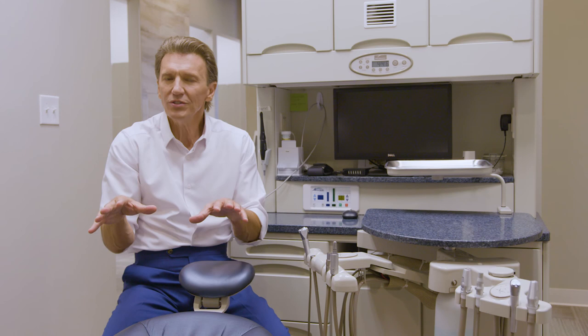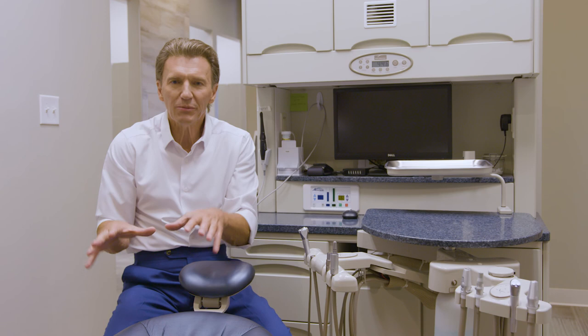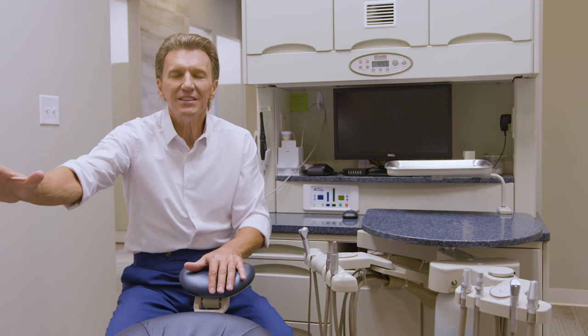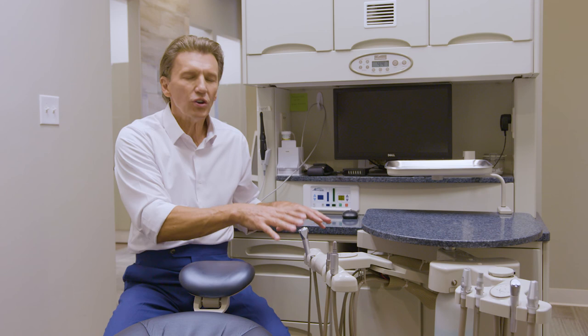Our main two options are: split delivery, where the doctor's module is attached to the chair — great ergonomically in the seated treatment position, but it creates pathway challenges on the operator's side of the dental chair. Or dual-function flexible rear delivery, where you hide the hand pieces from patient view, but you introduce ergonomic challenges because you're turning to one side to retrieve your hand pieces. Those are your two options.